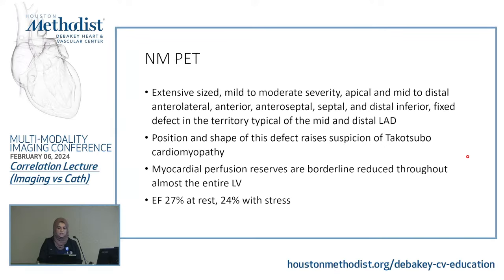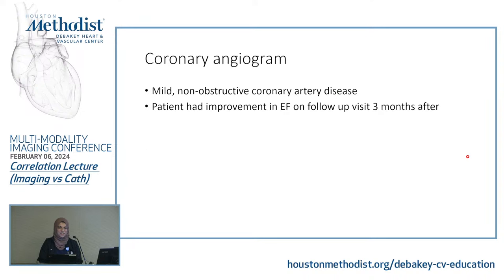The patient, we reported exactly as Salim mentioned: an extensive mid to distal defect that's fixed. While this could be typical of mid to distal LAD, given that it traverses three vascular territories, it could be Takotsubo, keeping in mind the patient's clinical presentation. However, Takotsubo is a diagnosis of exclusion, and a PET should not have been ordered on this patient. A coronary angiogram showed non-obstructive disease, and on follow-up, the patient had improvement in EF on just medical therapy.